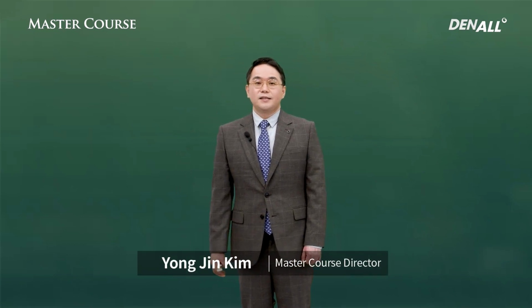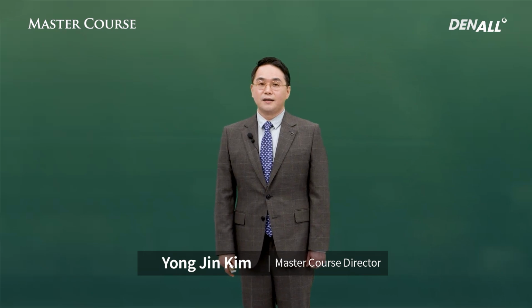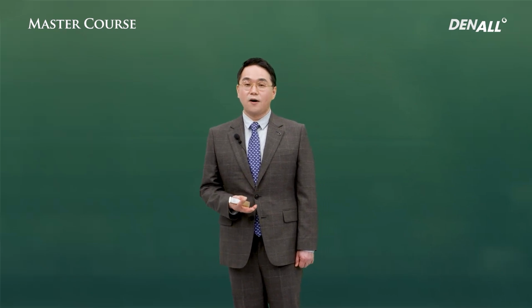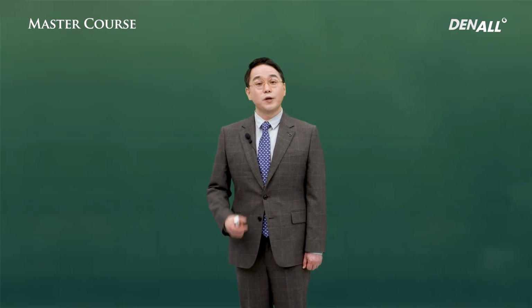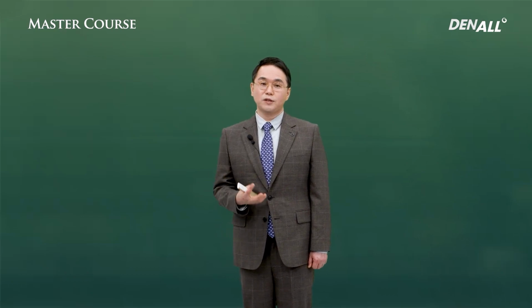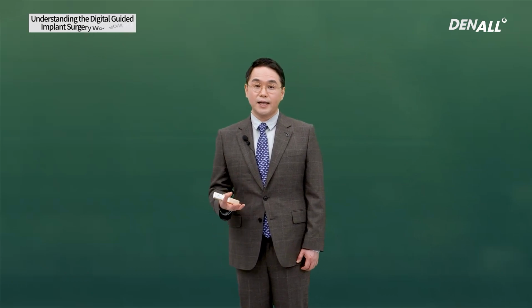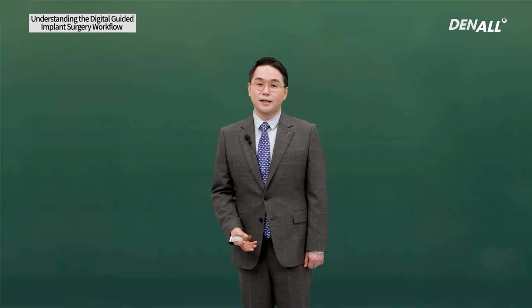The market of digital dentistry is huge and evolving quite rapidly. The biggest advantage of using digital guided implant surgery is to do various implant planning with three-dimensional bone and teeth data from CT data and intraoral scanner or model scanner surface information.